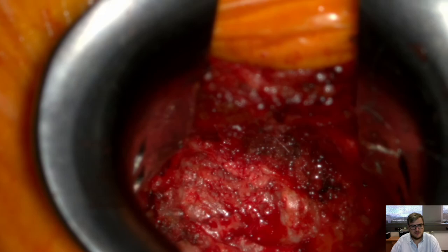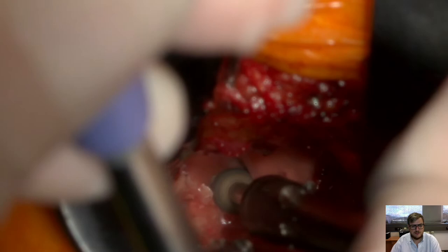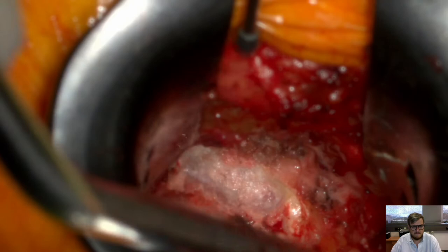You see the lamina on the top side and there comes the drill next. We perform a regular interlaminar fenestration and exposure of the yellow ligament.